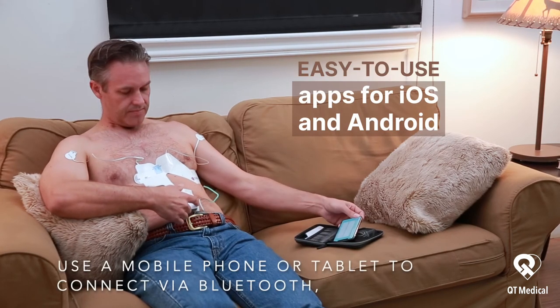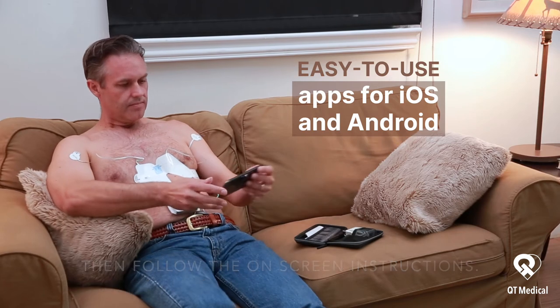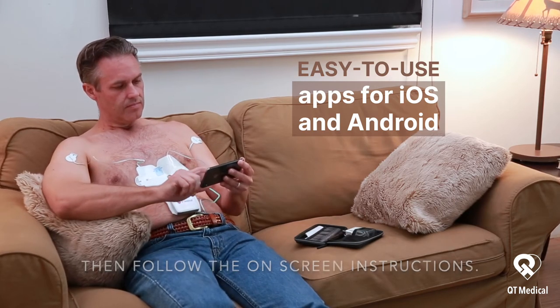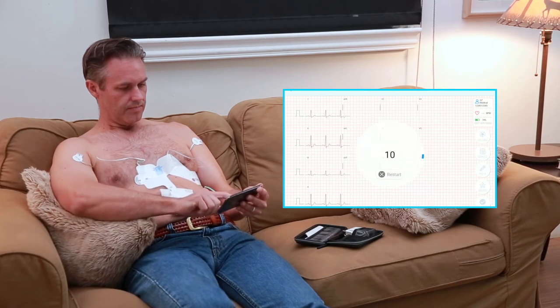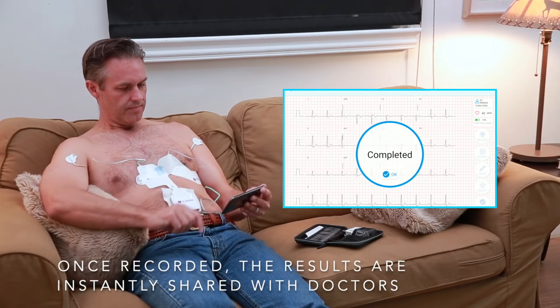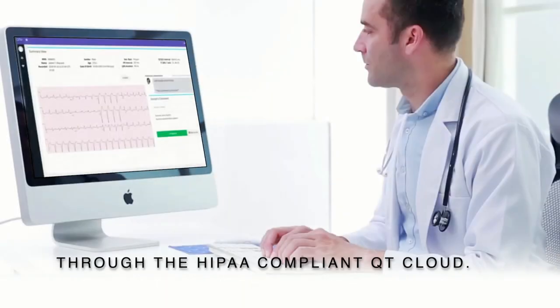Use a mobile phone or tablet to connect via Bluetooth, then follow the on-screen instructions. Once recorded, the results are instantly shared with doctors through the HIPAA-compliant QT Cloud.